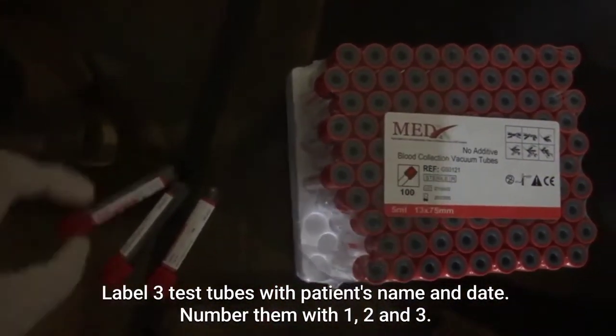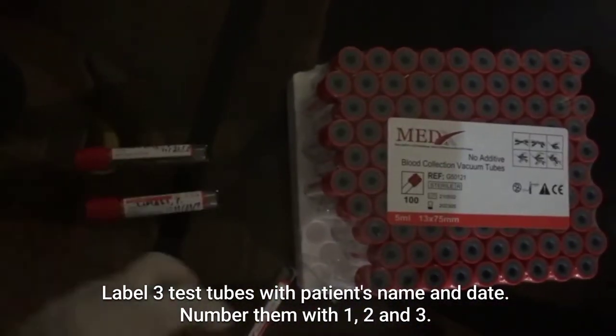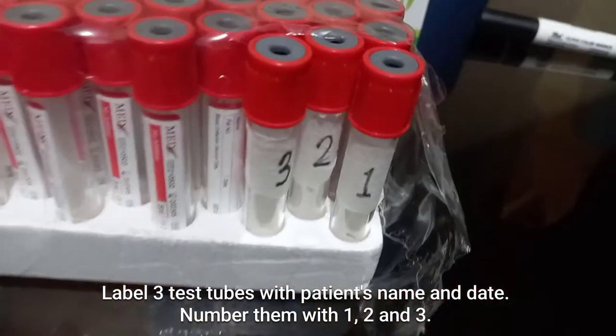Label the three test tubes with the patient's name and date. Number them 1, 2, and 3.